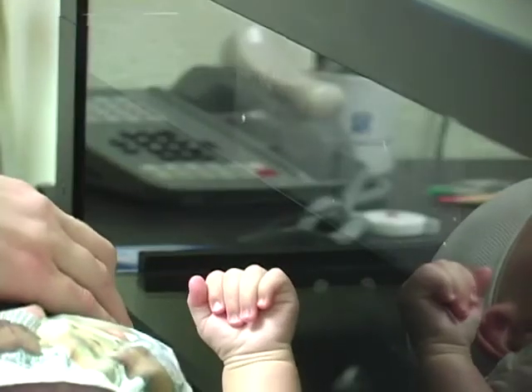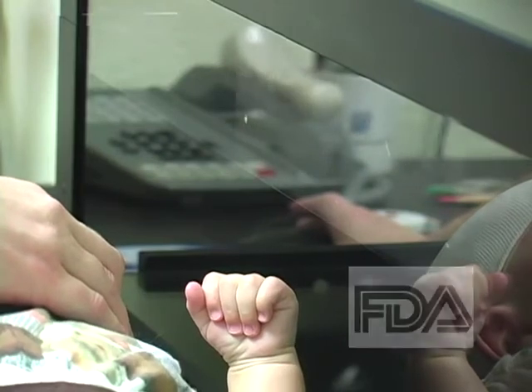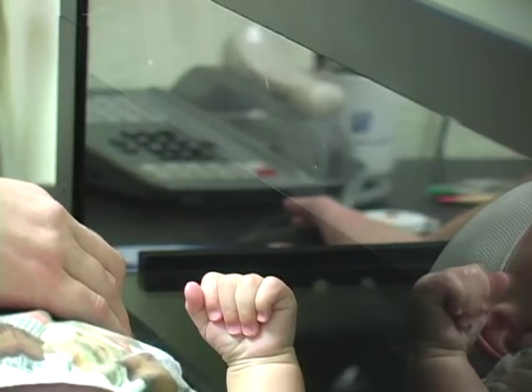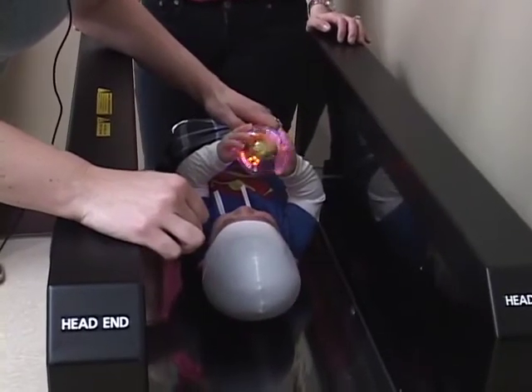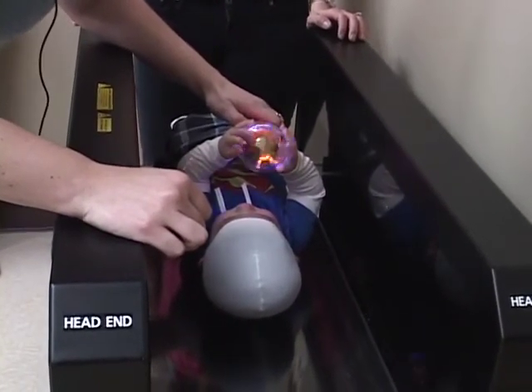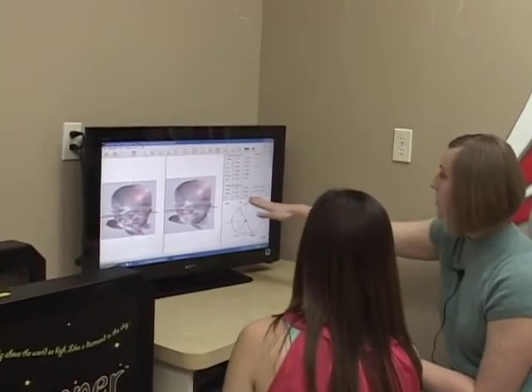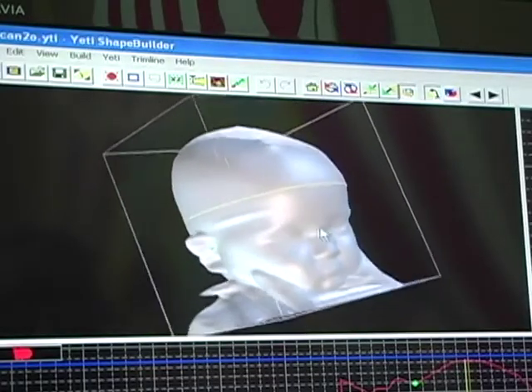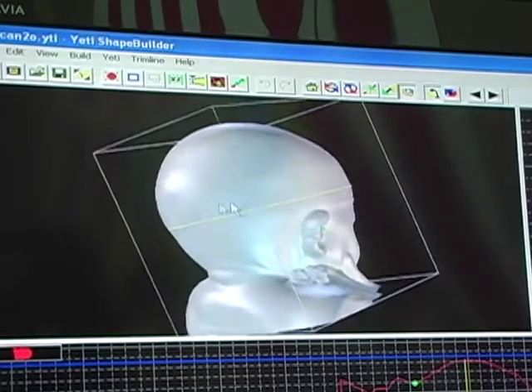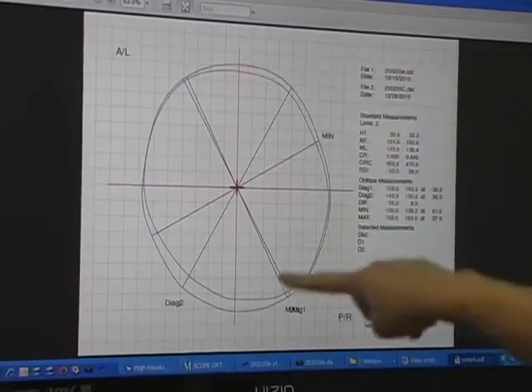The laser lights in the Star-Scanner are all Class 1 FDA-cleared medical lasers that are no threat to the patient's eyes. In the Star-Scanner, unlike an X-ray or MRI machine, there is no concern of exposure to the patients, as no eye protection is needed. Once the scan is completed, the practitioner places pertinent landmarks on the 3D image, and the scan is then opened in the other software called the Cranial Comparison Utility. This software is used to evaluate the cranial symmetry and proportion throughout the whole treatment process.